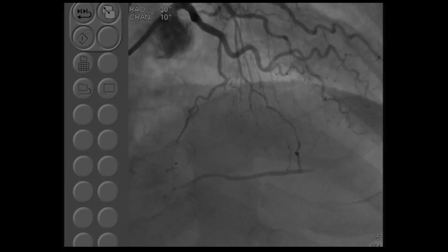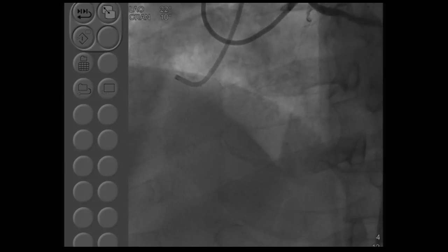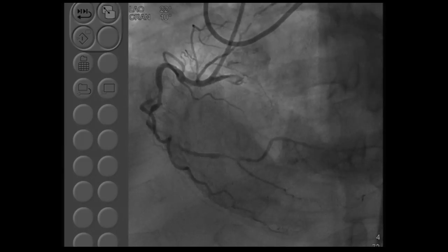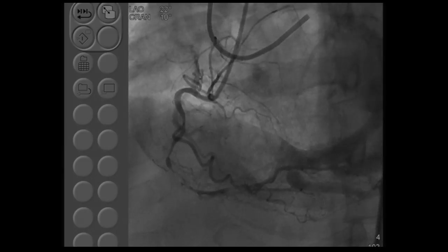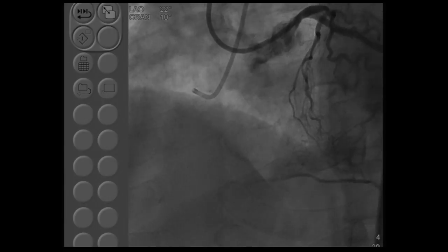The question always comes, and we'll discuss it: if you go to the previous view, why not antegrade in this particular case? What deters you from going through the antegrade? The same thing that we mentioned here is, one, the multiple bridge collaterals.